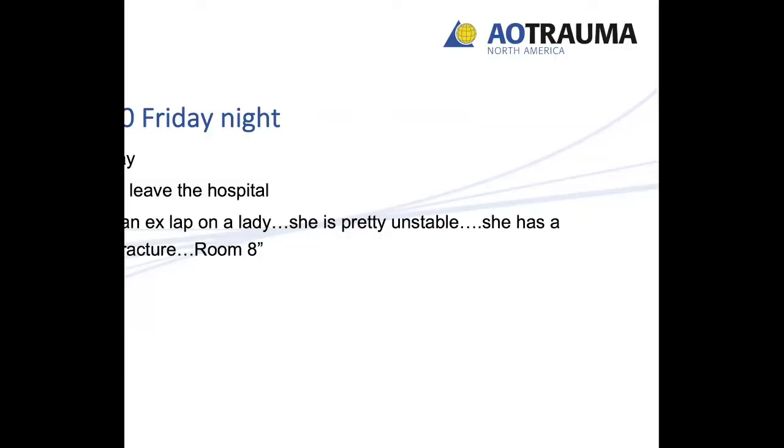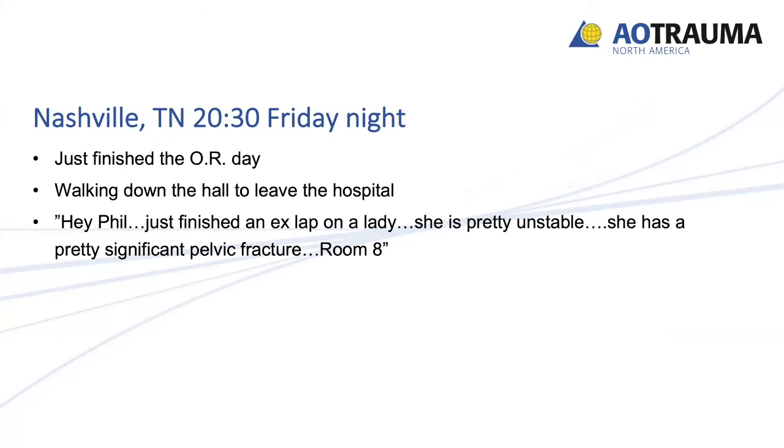No, there were a few questions about whether an extended iliofemoral would be useful in this case. I think that's really not going to provide any advantage, with significant morbidity as we heard about, compared to what was done here with a Gibson and a trochanteric osteotomy. Yeah, I would agree. It certainly would give you the visualization you would need, but at a much higher cost.